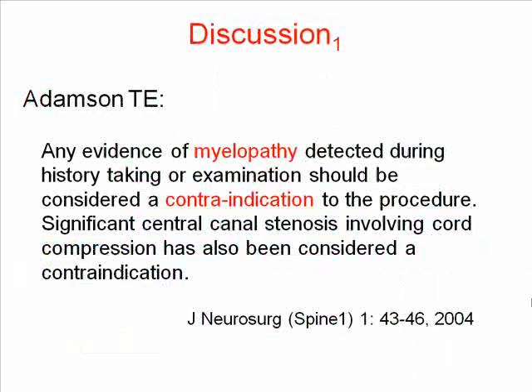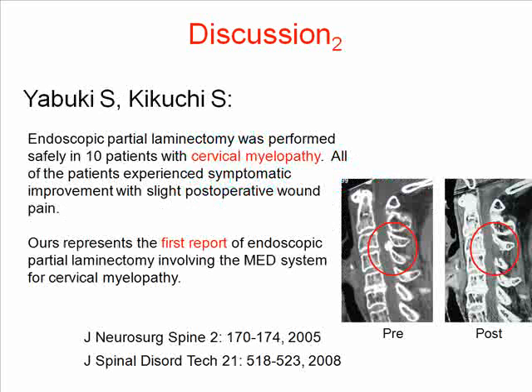Discussion. Adamson described that myelopathy was a contraindication to the endoscopic procedure. However, we first reported that endoscopic surgery could be performed in patients with cervical myelopathy.